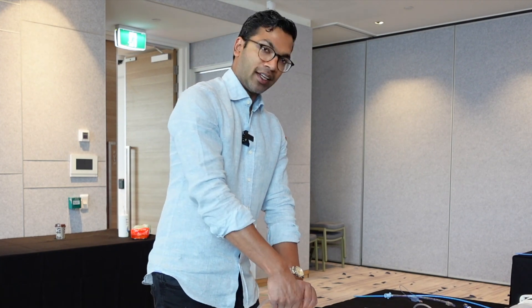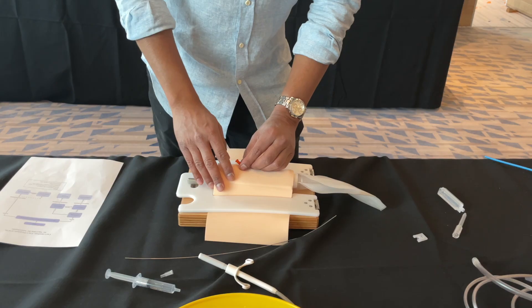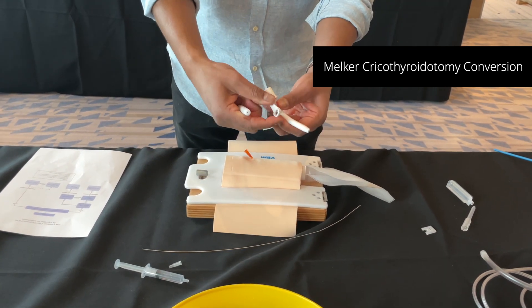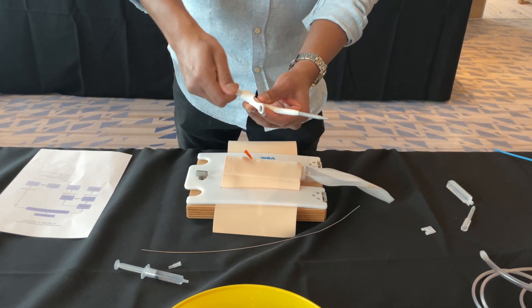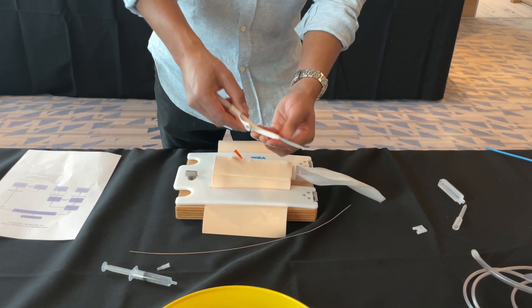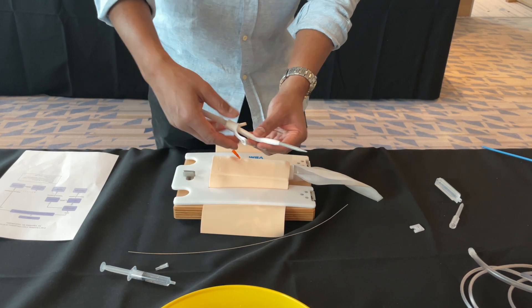Once I've got the patient to a level of safe oxygenation, I can then convert this to a Melka kit. I remove the Rapid O2 device. The Melka kit is essentially a wire, a dilator, and a tracheostomy device — that's what it looks like together. This allows you to pass it over the wire and railroad it across with a Seldinger technique into the trachea. It also comes with a scalpel.